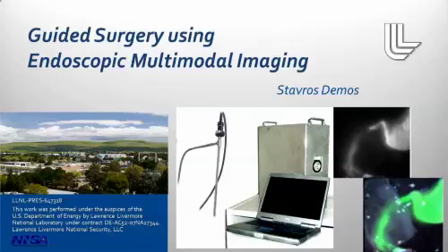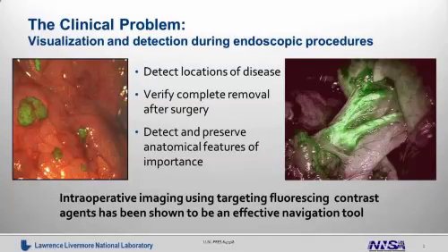Various imaging modalities developed over the past few decades, such as MRI, ultrasound, PET scan, and other technologies, have become indispensable tools for preoperative screening. However, translating these still images into the surgical theater still remains a major challenge. That's because the tissue is soft and moves around. So as a result, in daily surgical practice, the surgeon has to rely on visual perception and maybe palpation when it's possible. There is a well-recognized need for development of new intraoperative imaging modalities.